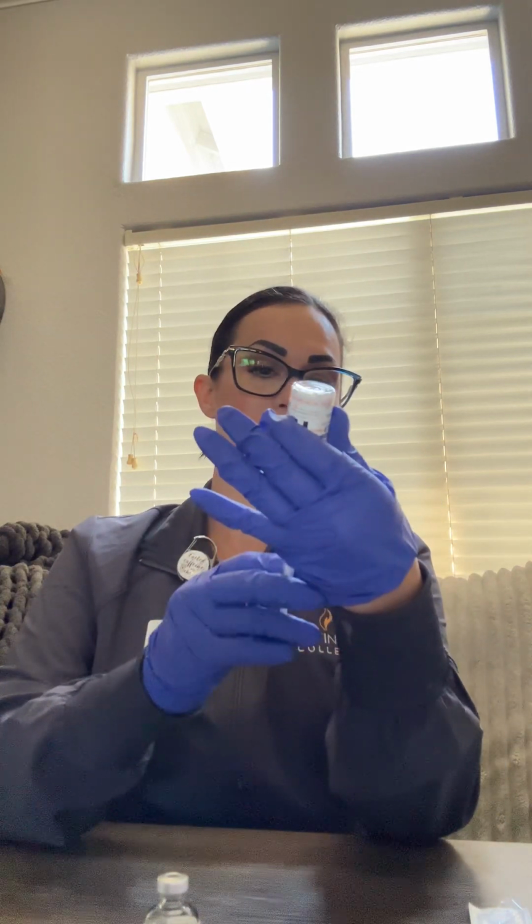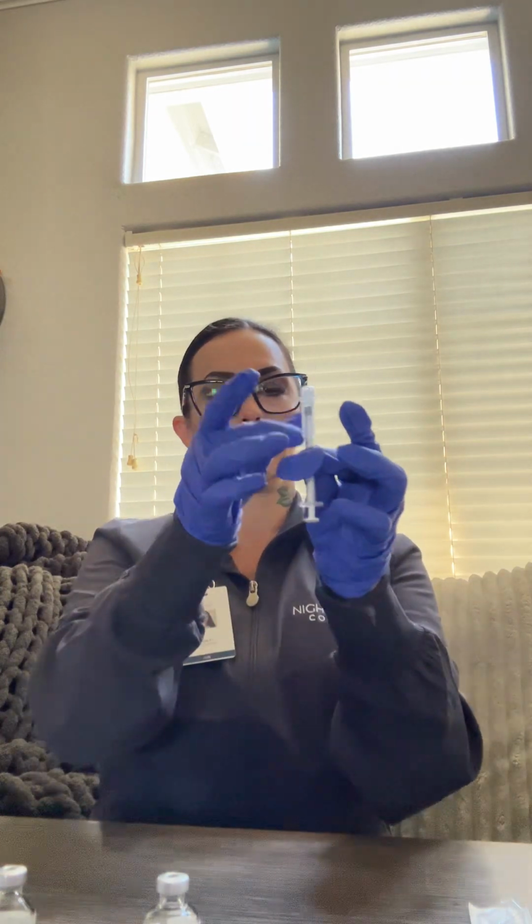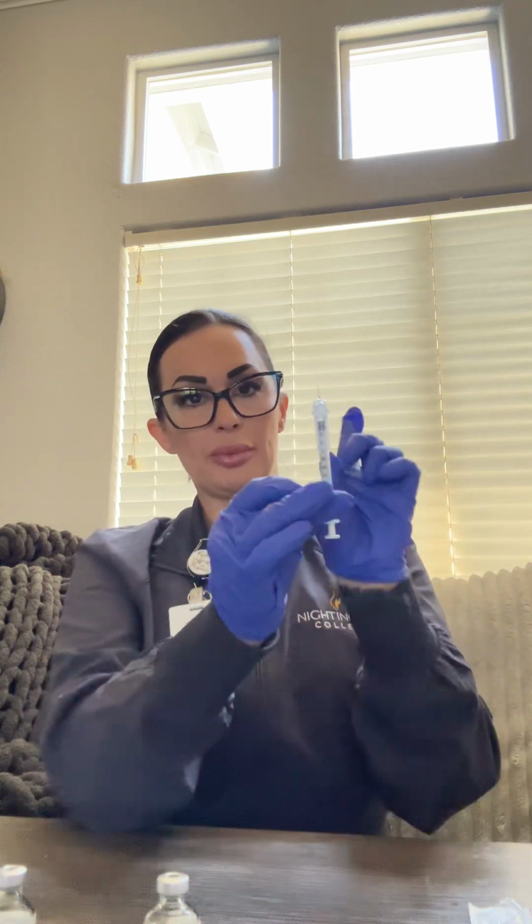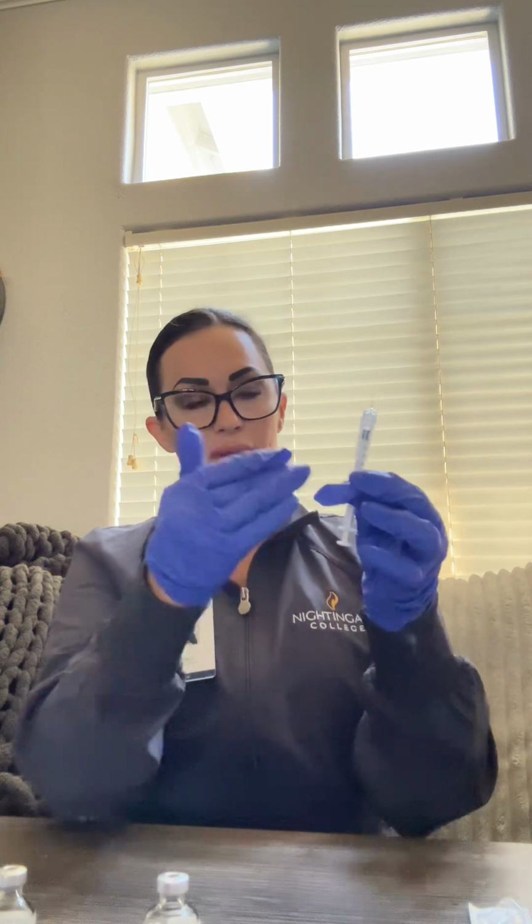You will invert the bottle, and now you will draw up your 4 units of medication. You also want to be sure to remove any air bubbles. Push up on the plunger, making sure that there are no air bubbles in there.